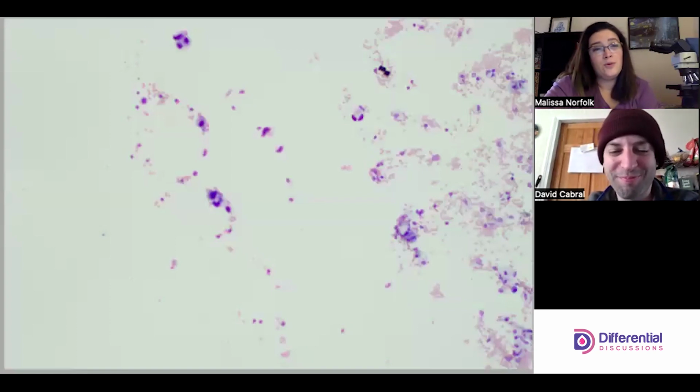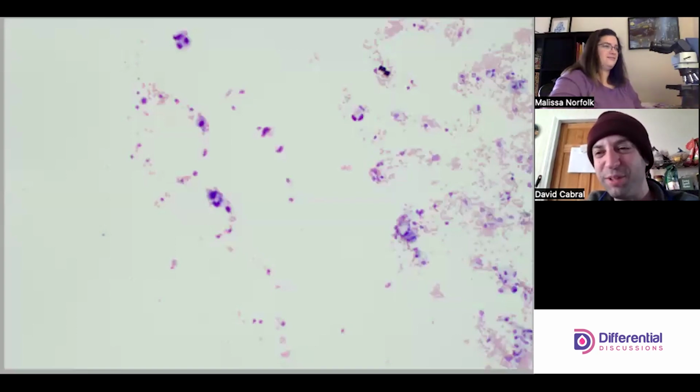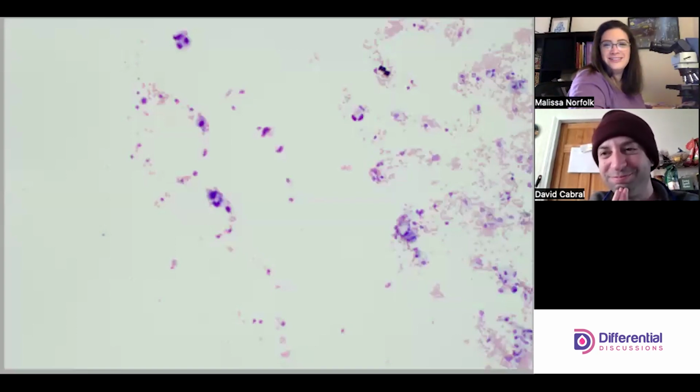And we're back with another serous fluid. Yummy. Yummy is probably not the right word, but yummy's great.